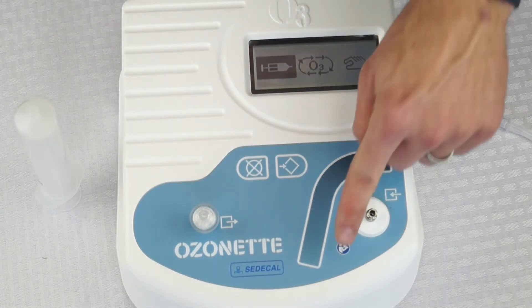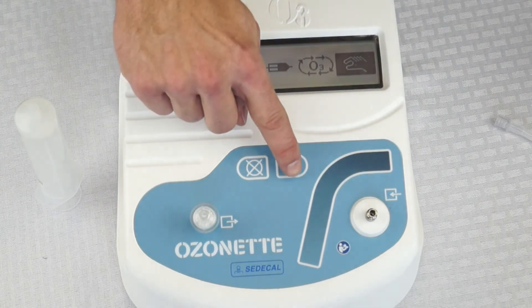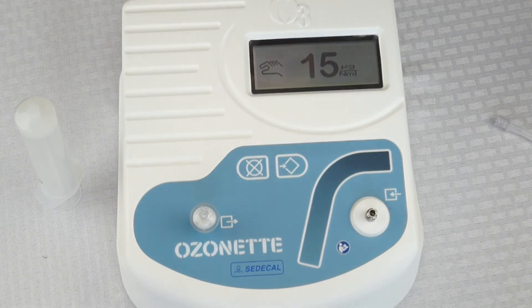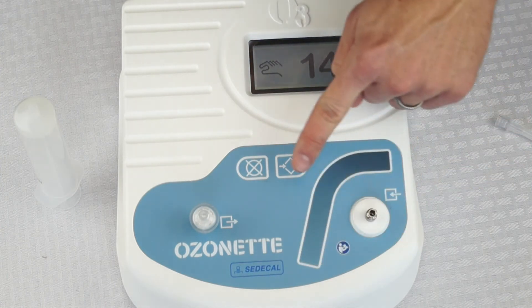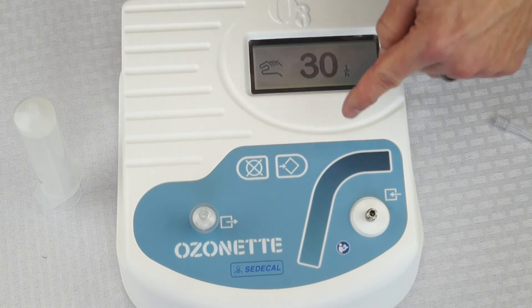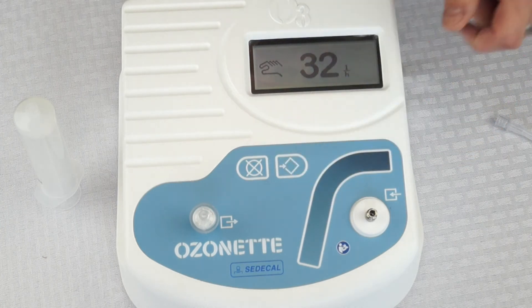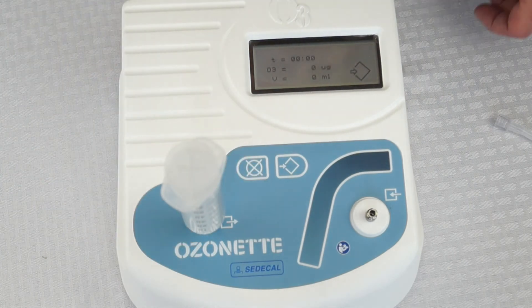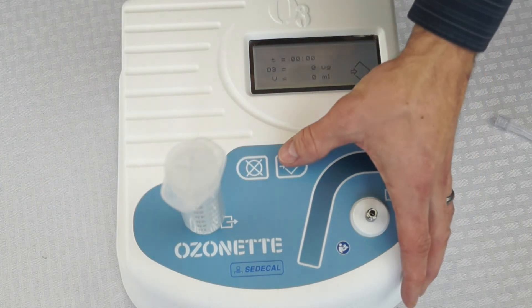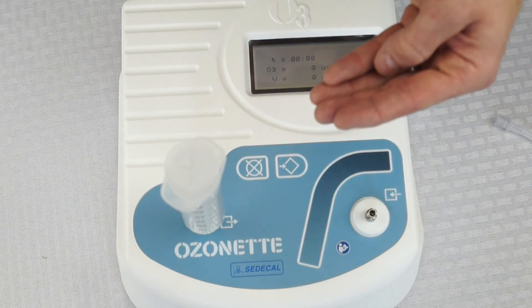The third setting is manual mode. Hit enter, set your concentration value, hit enter, then set your speed of flow and hit enter. Connect your syringe to the port. In this mode you have to hold the enter button down for it to produce ozone.